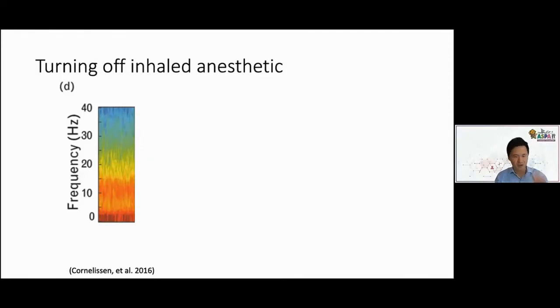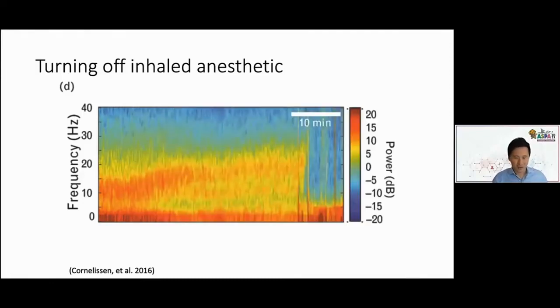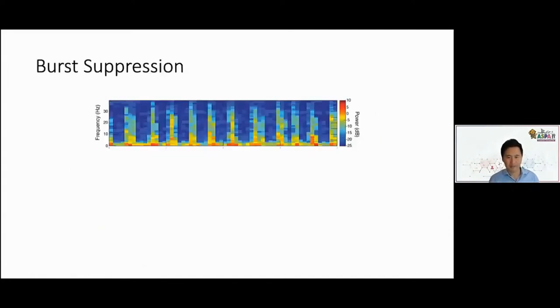Okay, so now what happens when you just turn everything off? Just like with propofol, this alpha peak frequency is drifting up into beta frequencies. The slow oscillation is getting smaller, so it's going from this very hot, dark red color to a lighter red color. And then at some point, the patient wakes up and the higher frequency oscillations just shut off, and are spread out across all the frequencies. The piano keyboard can play again, and then these little things here are actually eye blinks. All right, so that's sevoflurane and nitrous both turning off.